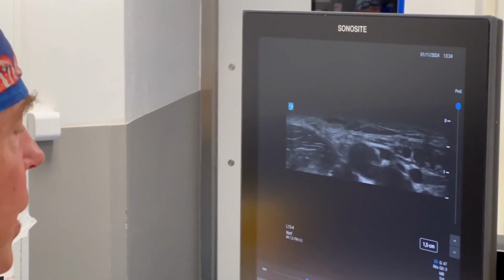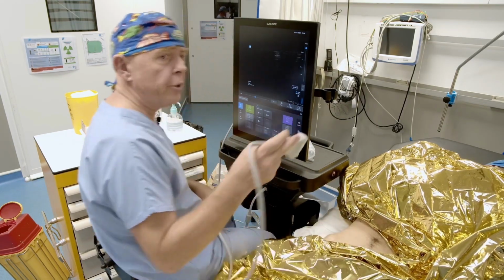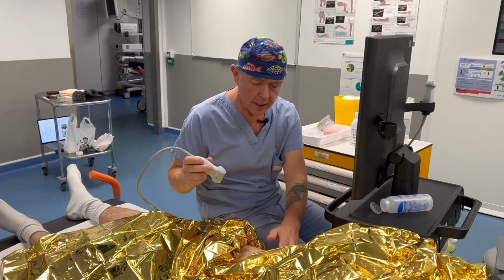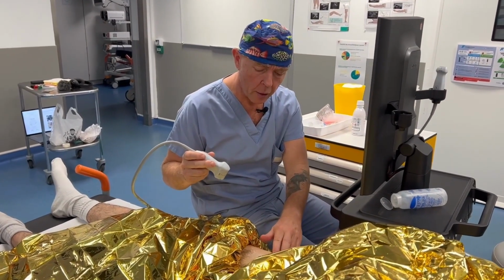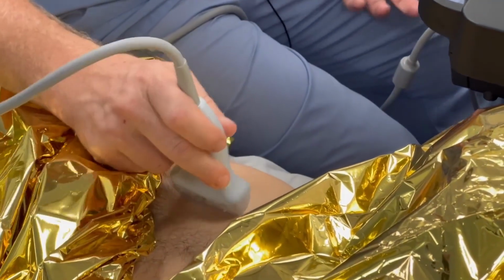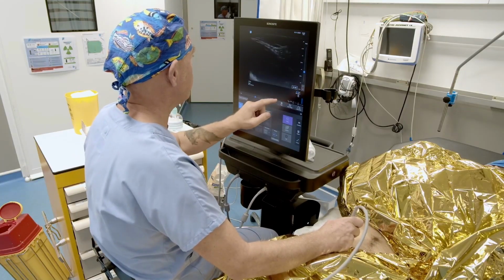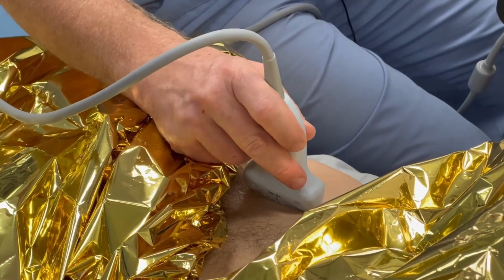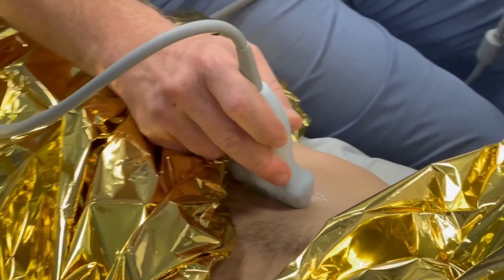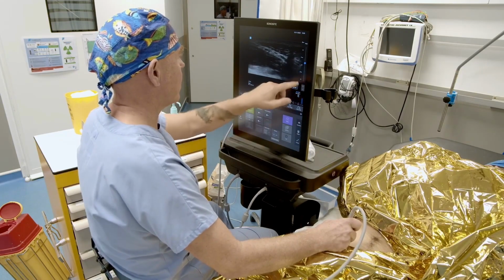nerve. I'm taking advantage of this position to show you the iliac fascia block via the suprainguinal approach. Your main landmarks will be the anterior superior iliac spine, the pubic symphysis, and then at the outer third, it's often a little bit. So here I've passed. Oops, now I have too much. All right, there we go now. And as you can clearly see, your landmarks are positioned right here. So this perfectly aligns with the anatomical diagram we discussed earlier.